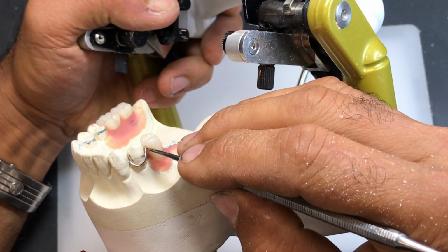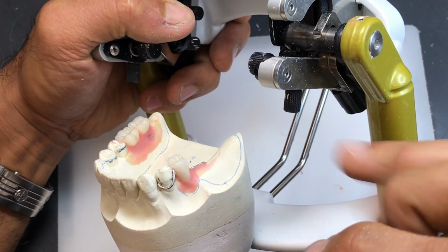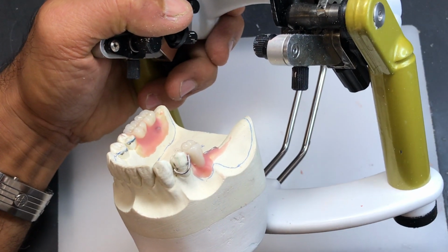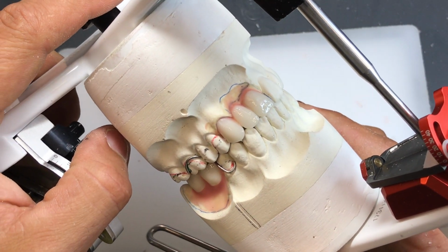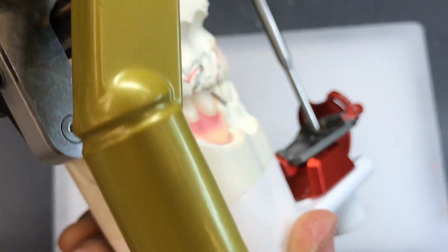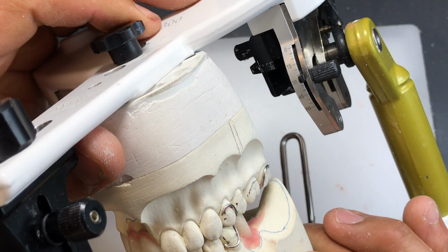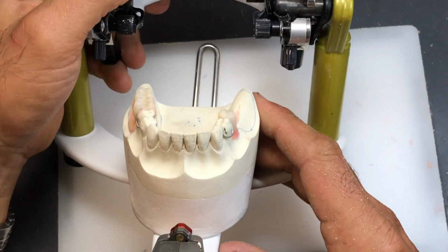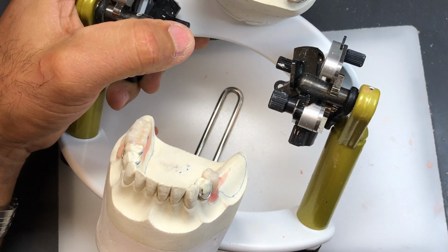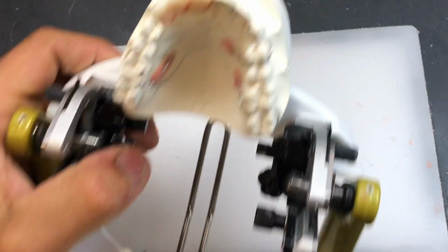I might have overground the tooth here a little bit, but nothing to worry about. Okay. Bring things together gently. Definitely the pin is slightly elevated off the incisal table. You can't see it on camera, but take my word for it. I'm looking at about 1/4 millimeter of a vertical opening now between this tooth and everything else, which is good. That's what I'm looking for. I'm just going to chill the wax a little bit with the air nozzle.